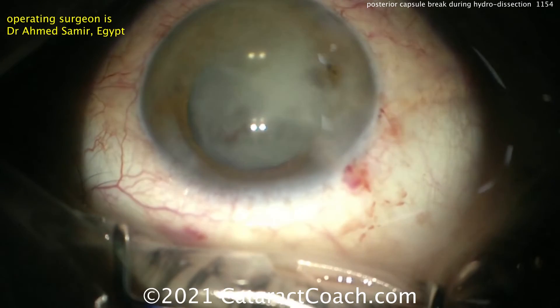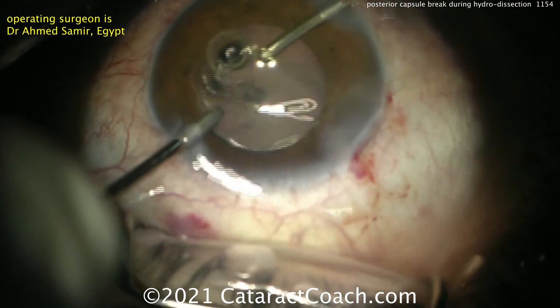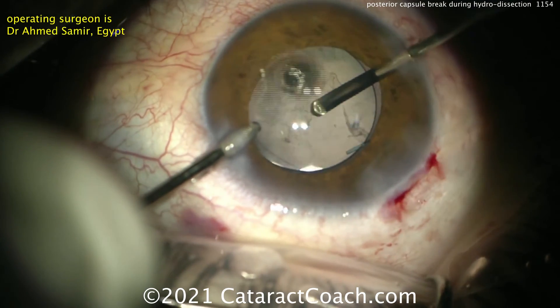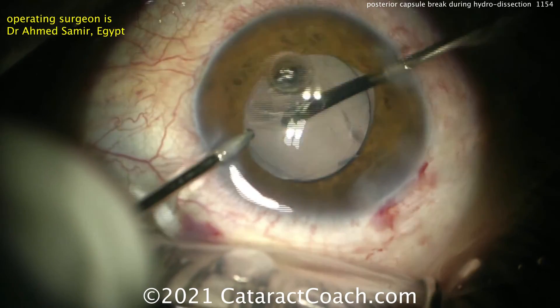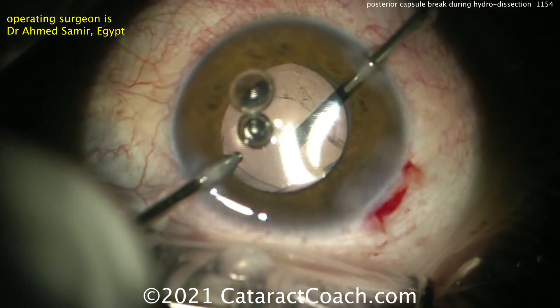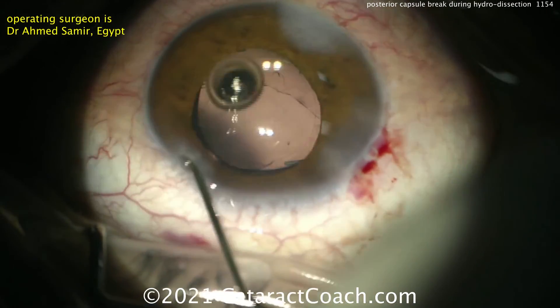There's the Triamcinolone — good job putting that inside the anterior chamber. You can see there's no vitreous prolapse. This is a very successful case. If you have any doubts, you can put in the bimanual vitrector setup. At this point, lower the infusion pressure or bottle height to make sure the lens stays stable and doesn't get pushed around too much, because it's only being supported by those haptics in the sulcus and remember the capsulorexis is not fully intact. Nice save at the end of the day.